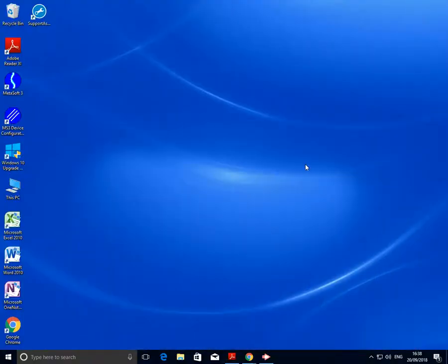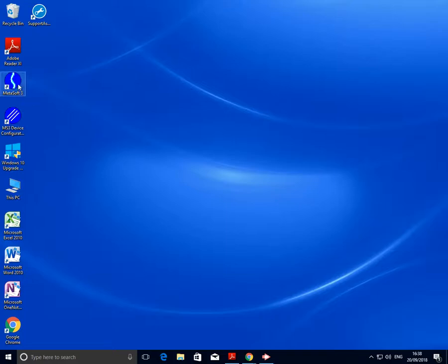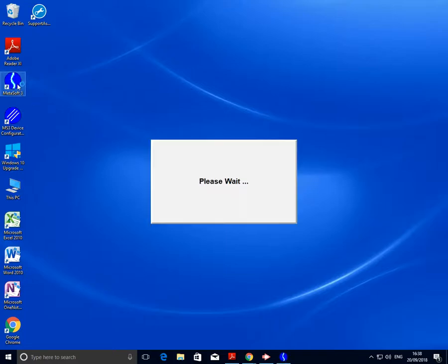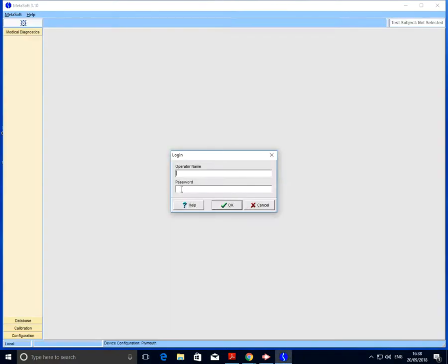Once we're satisfied that the Cortex is sufficiently warmed up and we've got all the necessary equipment, we can go ahead and enter the software. From the desktop we're looking for the Metasoft 3 software, and the operator name and password are both cortex with a capital C.